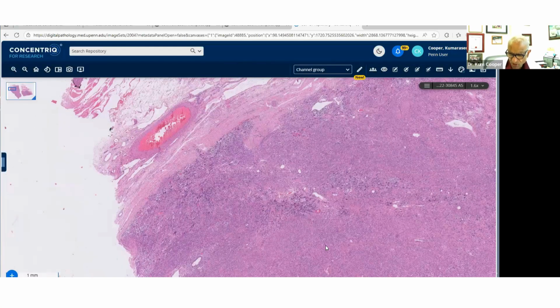Now, with the immunohistochemical panel of diffuse desmin, diffuse SMA, I would move away from synovial sarcoma just based on immunohistochemistry. Okay, you could use TLE1, which people have put forward as supporting synovial sarcoma, but that is really not very specific. We've seen other tumors come up with TLE1, like MPNST, etc. So don't rely on TLE1 alone. You'd have to resort to molecular testing or antibodies to these fusion proteins that I talked about. So morphologically, though, that was the immuno and the FISH.